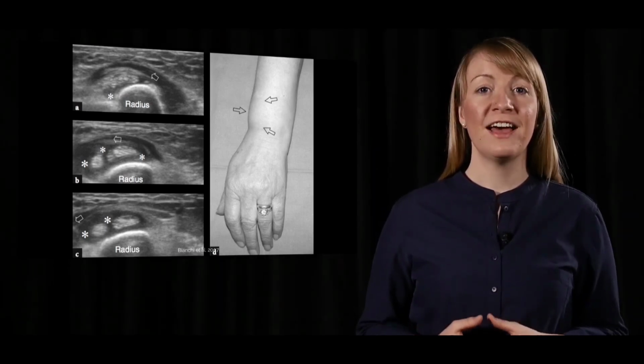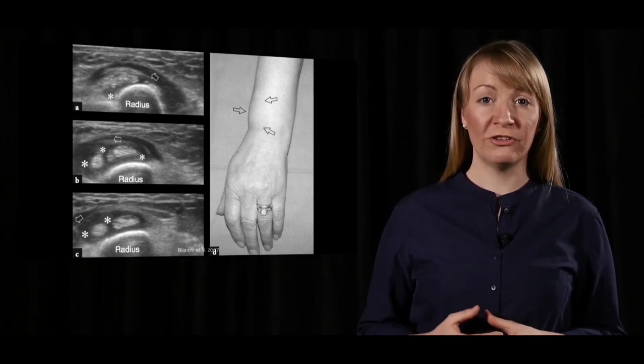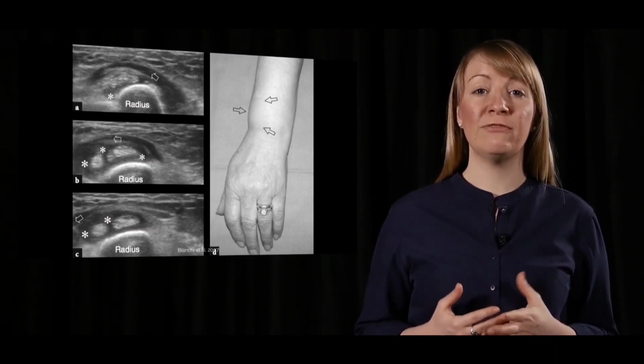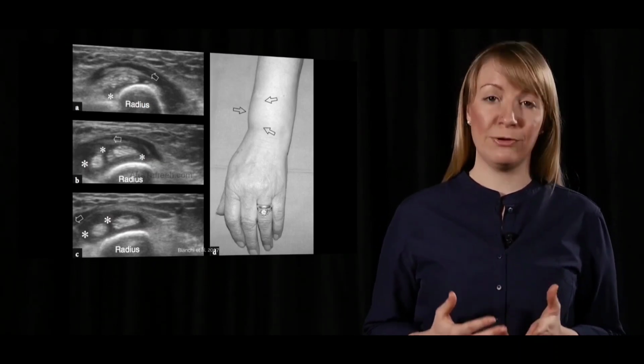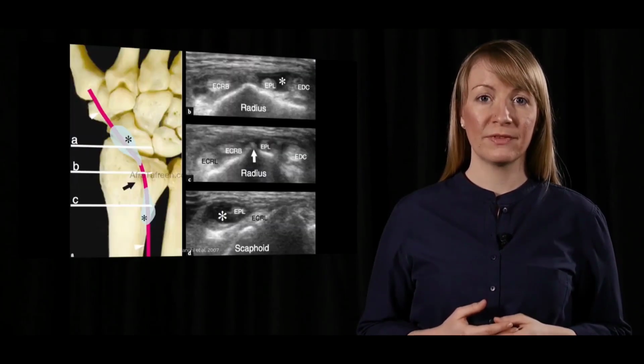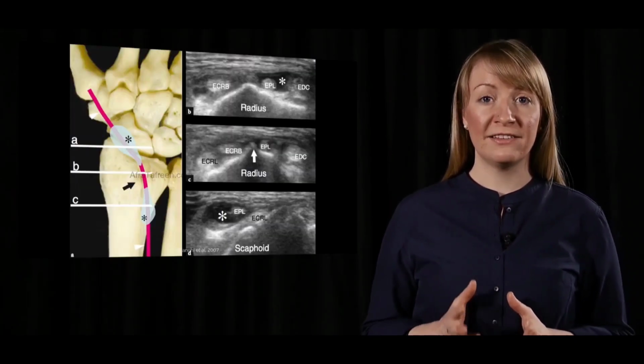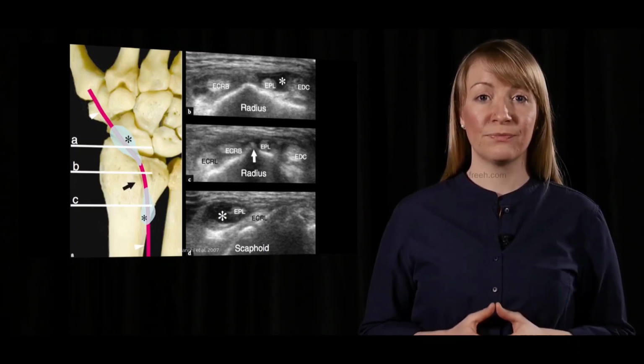Measurements of the tendon and retinaculum thickness and cross-sectional area have to be made to accurately document the pathology for diagnostic and/or evaluative purposes. This is a transverse scan of the second and third extensor compartment of the wrist.